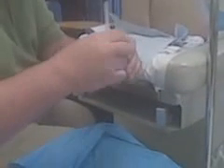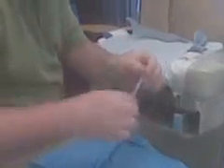Next thing I'm going to do is take my 3cc syringe. This will be for local anesthetic. I believe I put a 22 gauge needle on there, just to make it a little easier to draw it up. I'm going to switch to a larger needle, my 18 gauge, excuse me, 20 gauge. So I pop off the top of the lidocaine, draw up my 3 cc's of local anesthetic, then we're going to switch to my 22 gauge needle for the local infiltration.